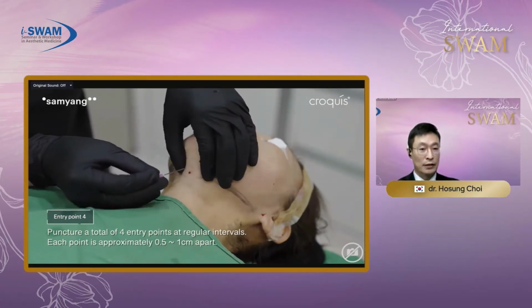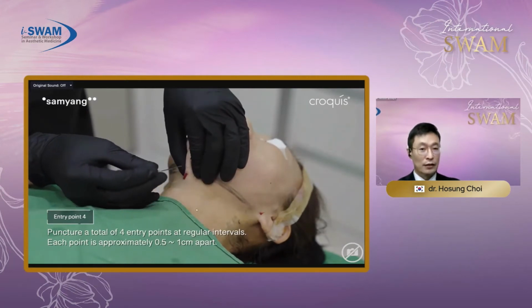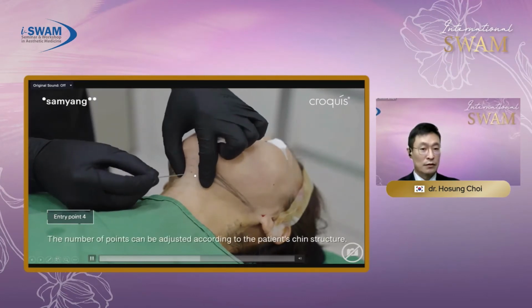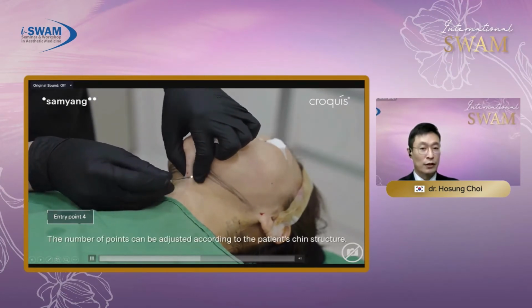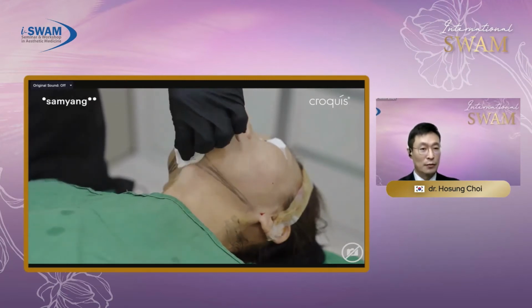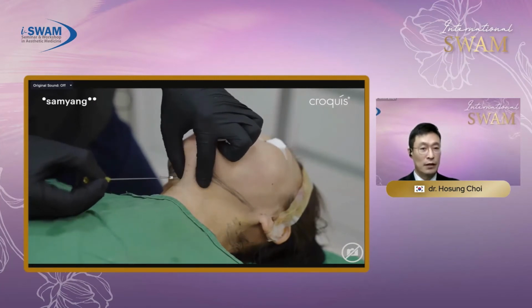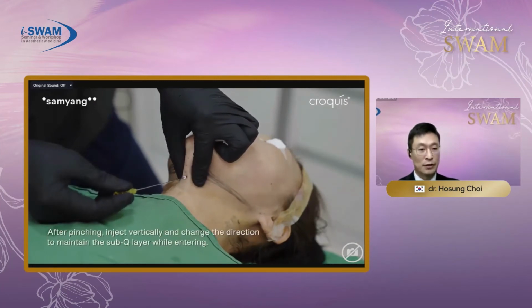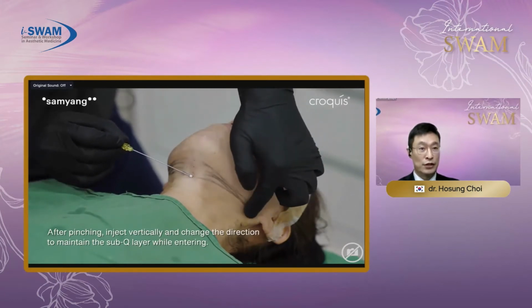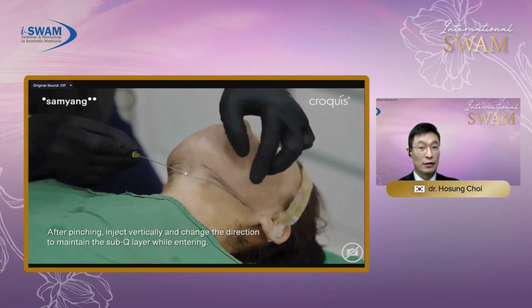I'm making a skin puncture using an 18G needle, and the distance between the two entry points is less than 1 centimeter, between 0.5 centimeter and 1 centimeter. And it's very important to approach vertically to the skin puncture in the beginning.